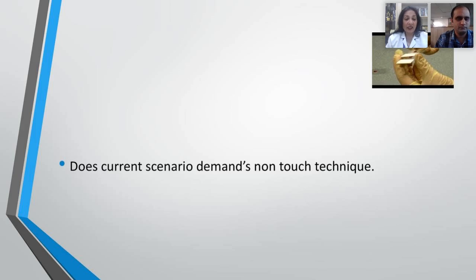It's very important because there are challenges which need to be taken care of when it comes to the touch technique. Although that's something we still believe a lot in, being pathologists, still the gold standard for us, where we manually want to review a slide. That personalized touch is immensely important.